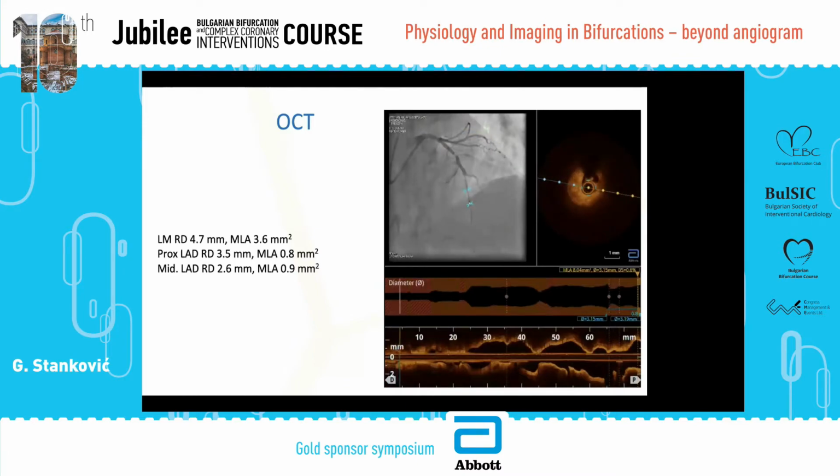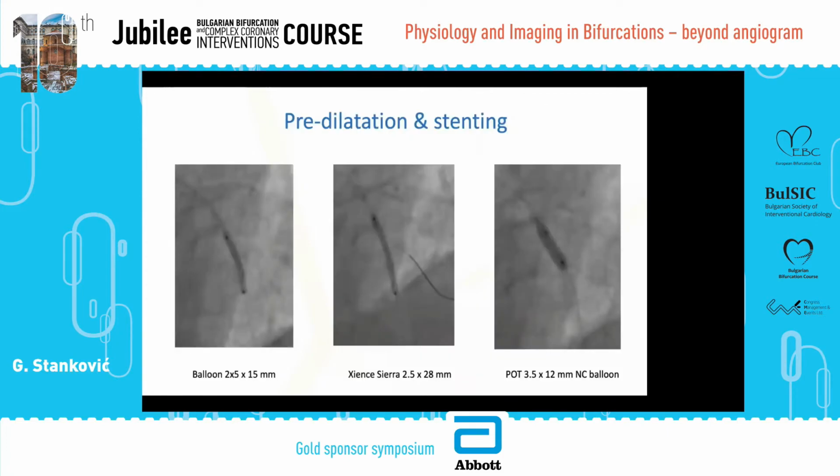So the whole segment needs to be treated, but we know that the reference for the proximal LAD is around 3.5 millimeters, distal is 2.6 millimeters.